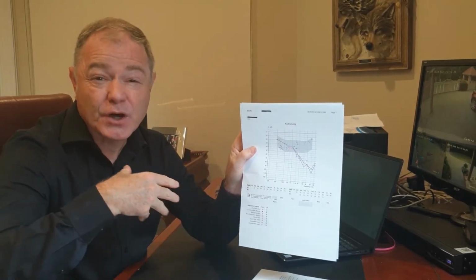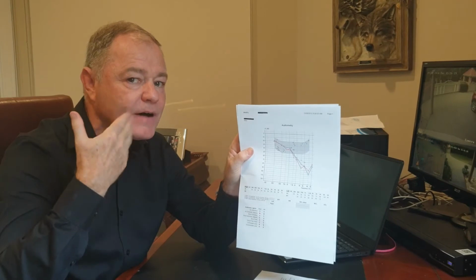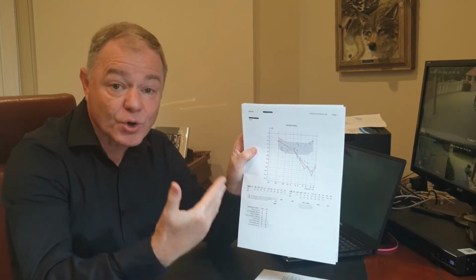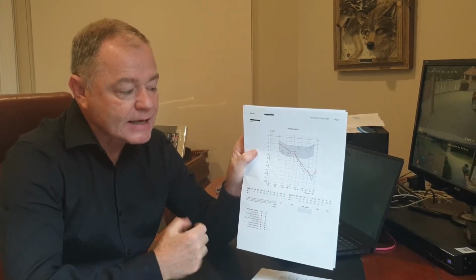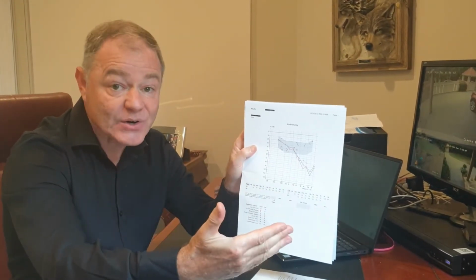Other than maybe if you've got a bad head cold, something like that, then you may find that it may be a temporary loss. You've got an ear infection. However, for most of these, if they're noise-induced, if they're drug-induced, if it's a cardiovascular issue, anything like that, like a hemorrhage, then these are going to be a permanent loss, and these are the ideal candidates for a set of hearing aids.